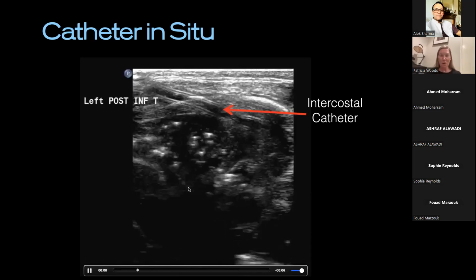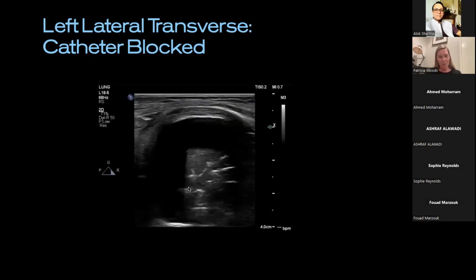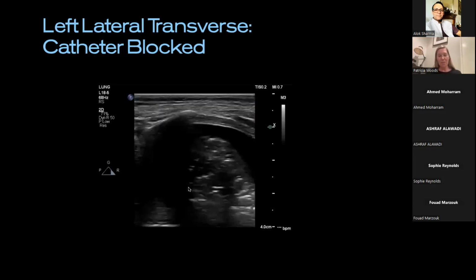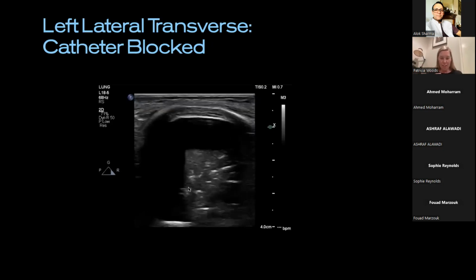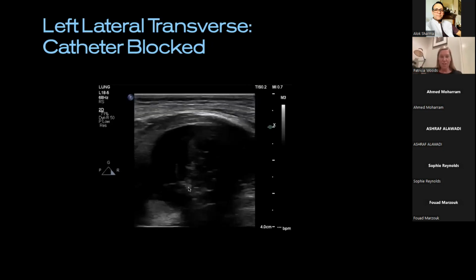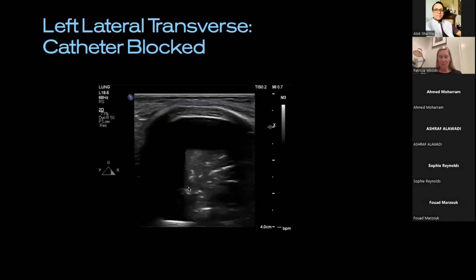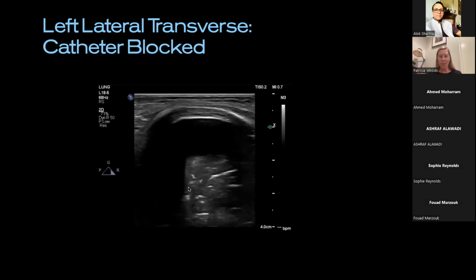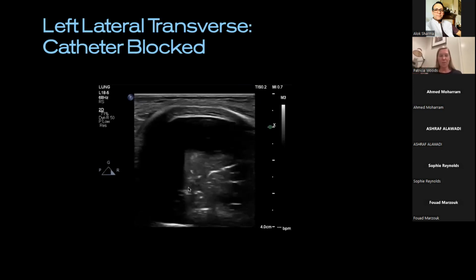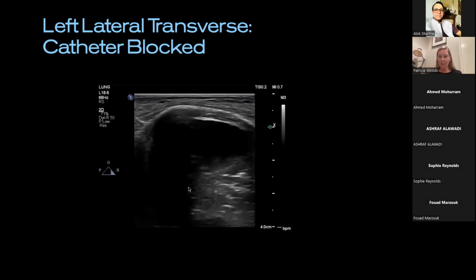Anyway, so catheter coming through. All right, troubleshooting. We all love catheters. So here I've got a left lateral. You can see the chest wall rib as it curves right the way around. And I've got this little bit of lung that's hepatized, just like the others. And it's like floating like a sponge to me. It's clearly not well aerated, is how I would put it in the notes. I cannot tell you if that's mucus, pneumonia, bleeding, edema. I can't tell you that.